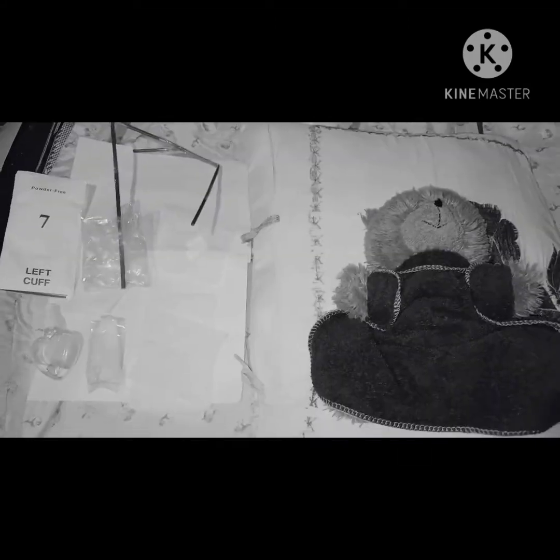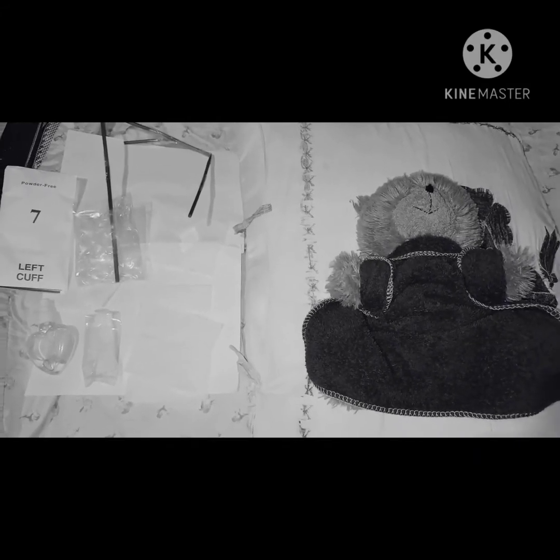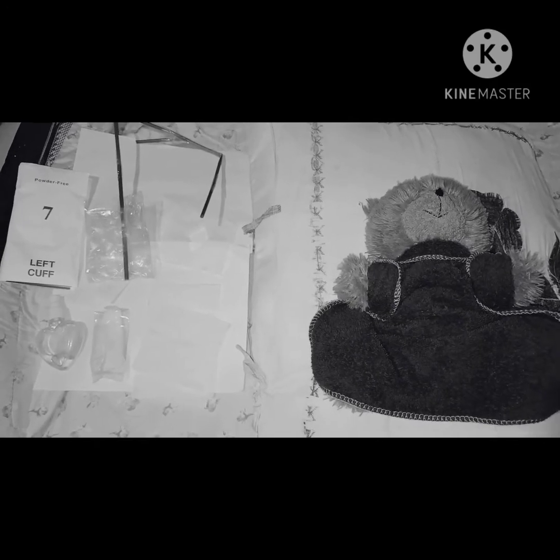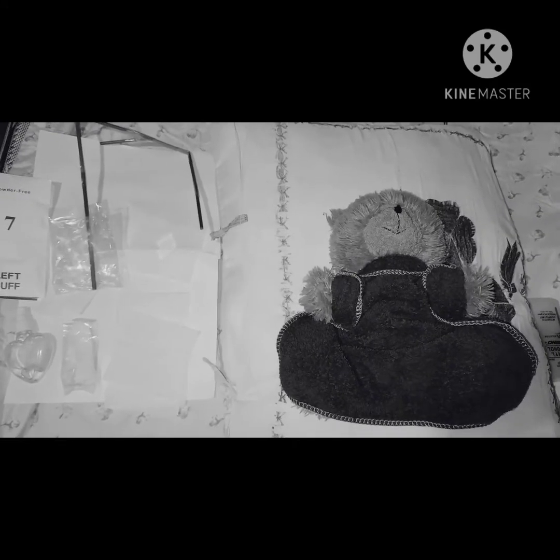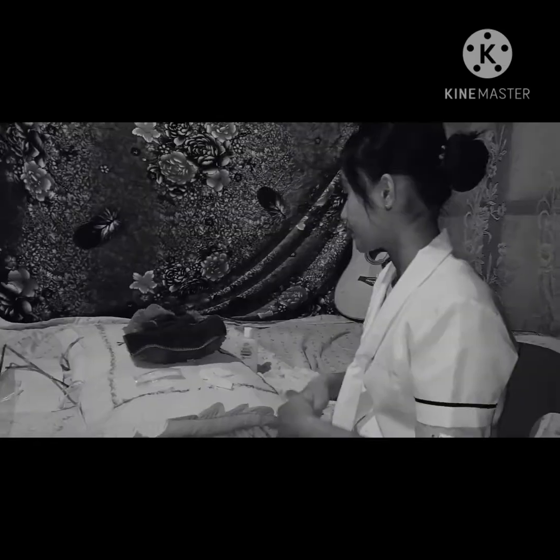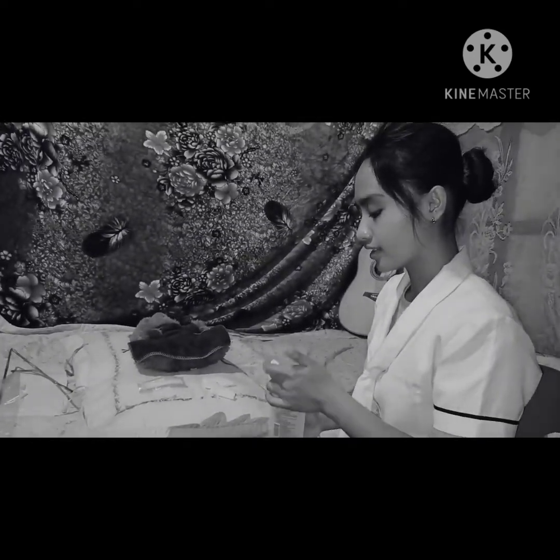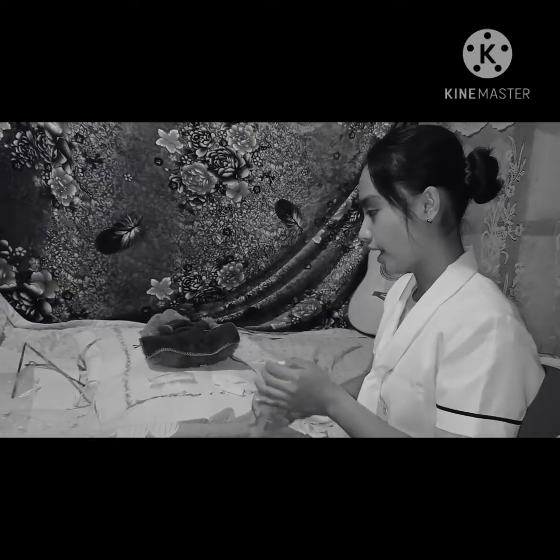Okay. Since all the equipment needed was gathered, now I am going to position my patient in the dorsal recumbent position, the knees up and the legs separated. Upon opening the urinary catheter, I must not touch the interior surface, and I make sure that I have done hand hygiene. So before starting the procedure, let's do hand hygiene.